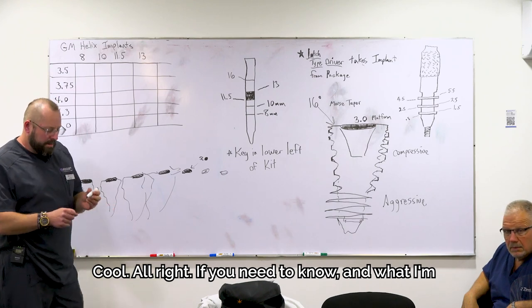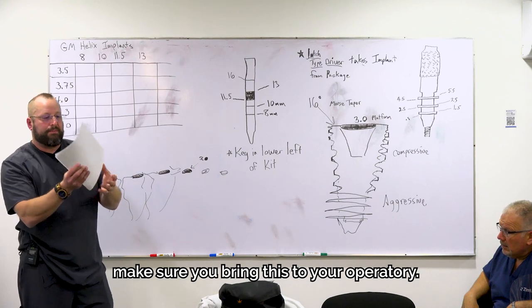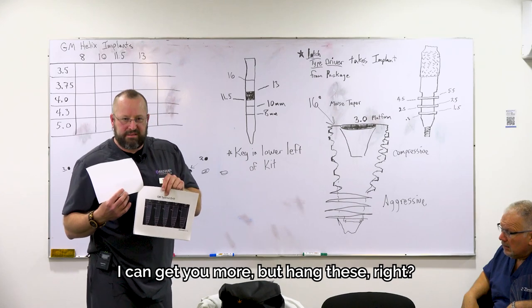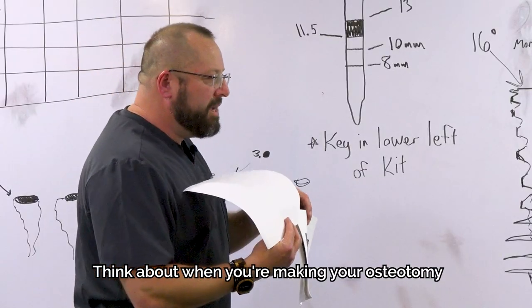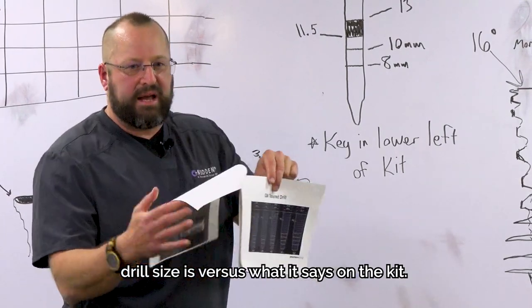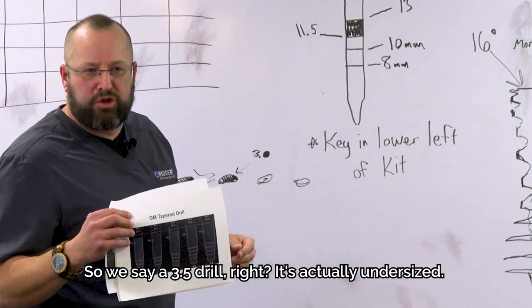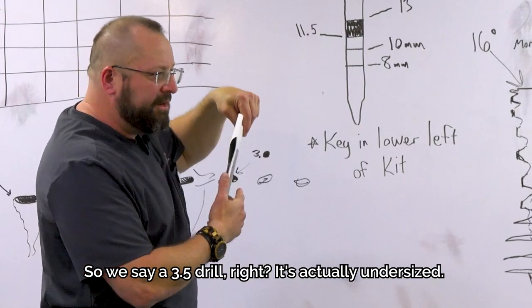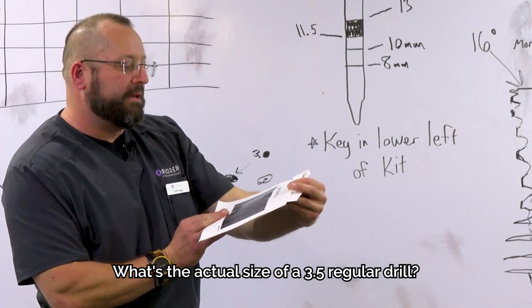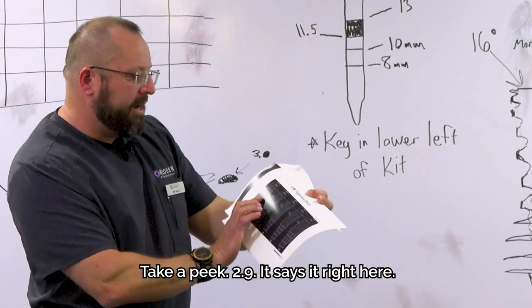Cool? All right. If you need to know, and what I'm going to ask is the folks that have this, make sure you bring this to your operatory. I'm begging you guys to pull this thing apart. I can get you more. But hang these. Right? Think about when you're making your osteotomy and what that type of bone is, and know exactly what the actual drill size is versus what it says on the kit. So we say a 3.5 drill, right? It's actually undersized. Help me out. What size is it? What's the actual size of a 3.5 regular drill? Take a peek. 2.9. It says it right here.